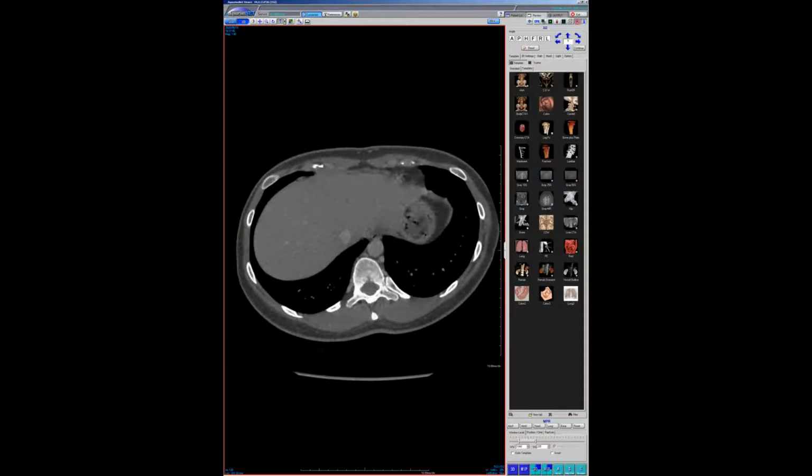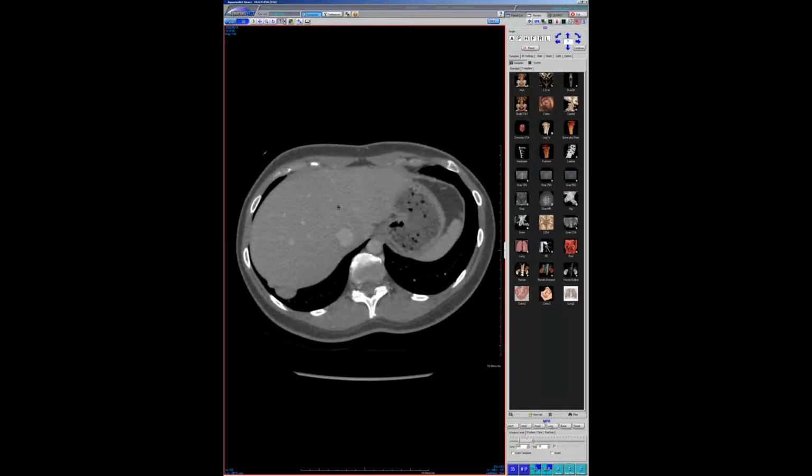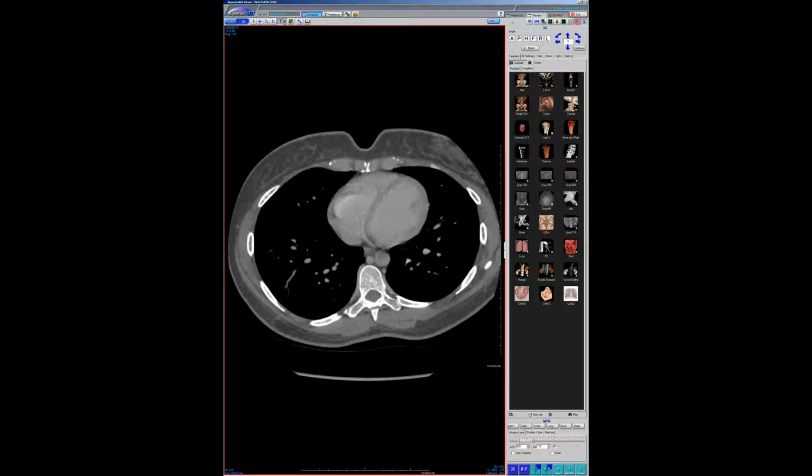I haven't seen a case of that in a long, long time. But I have seen macroscopic ones before, not as big as this, but say centimeter-sized nodules with this diagnosis. So they can be visible on CT scans. Yep. This was just something I haven't seen in a while.